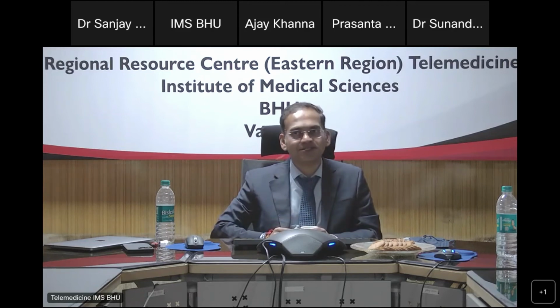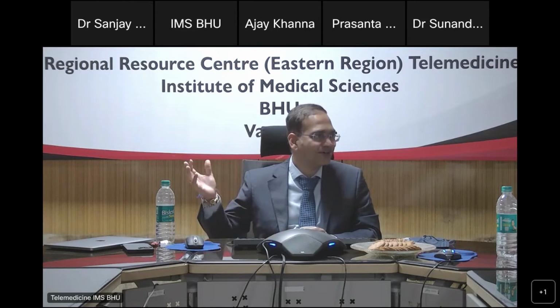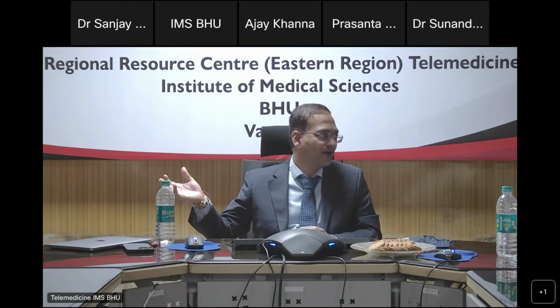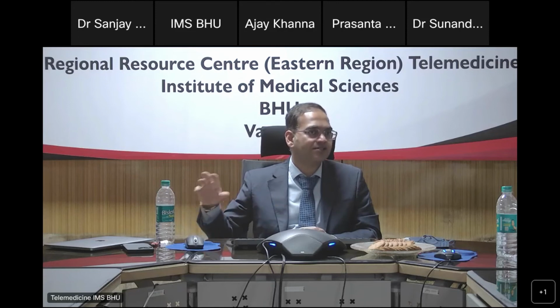That's an excellent question. The way our department is laid out is we have 12 magnets on the campus, and we have 20 CT scanners on the campus. So the number of CTs is obviously more in terms of availability. We do not have a dedicated scanner for cardiovascular cases; the MRIs are all shared across multiple divisions.